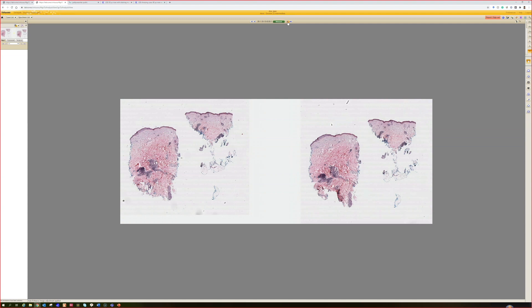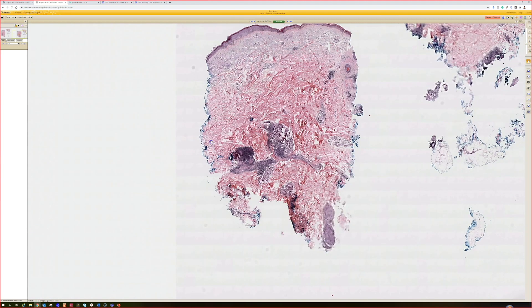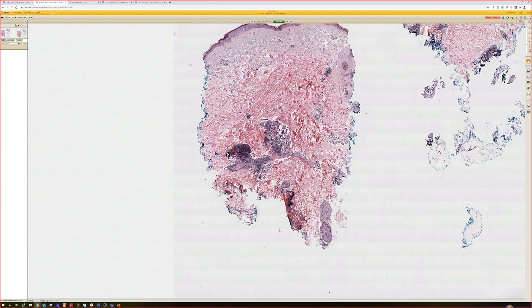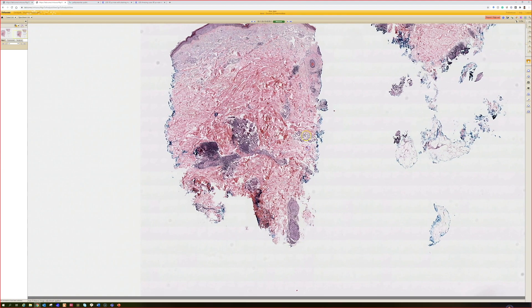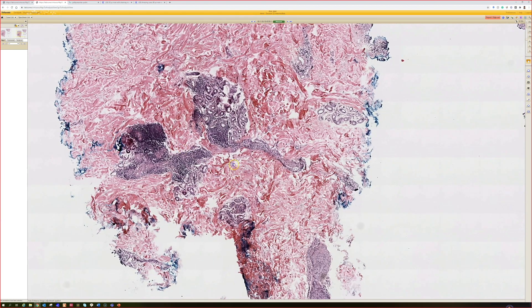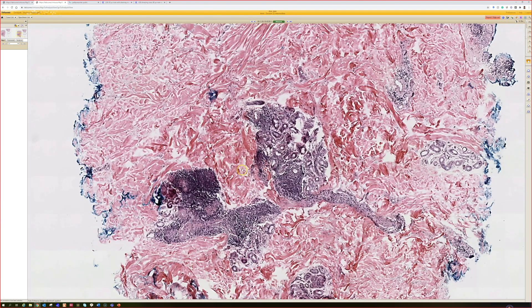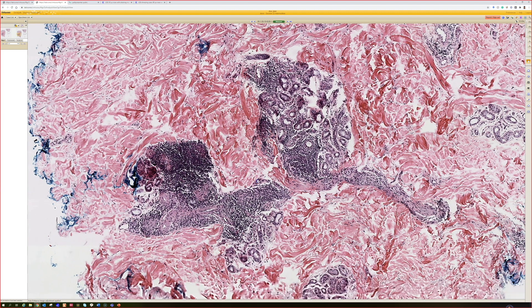This is case 18. Here we have a punch biopsy, and you can see that it's predominantly a periecrine and perineural lymphocytic infiltrate.